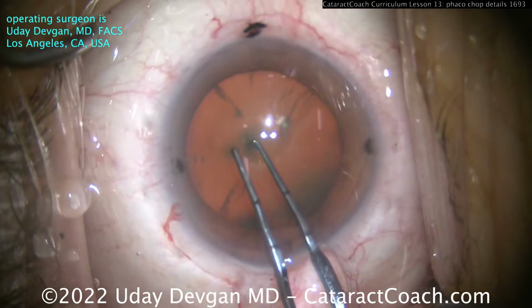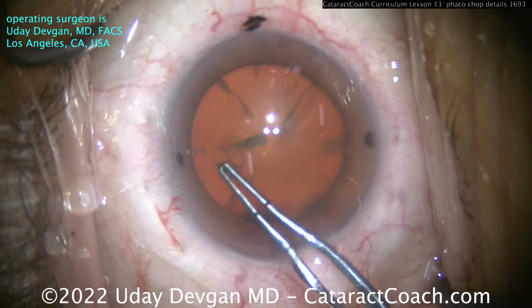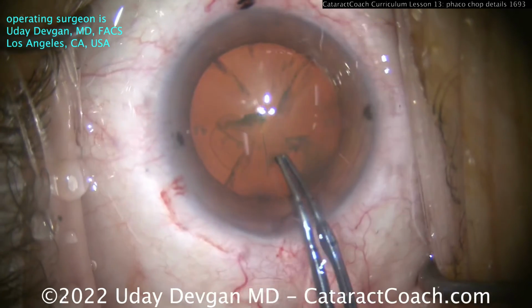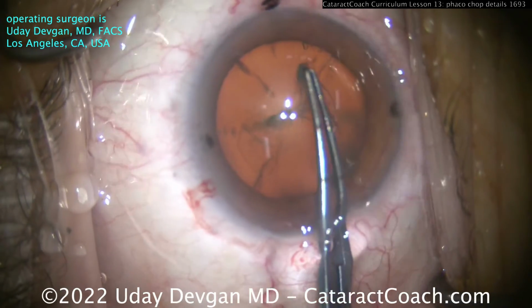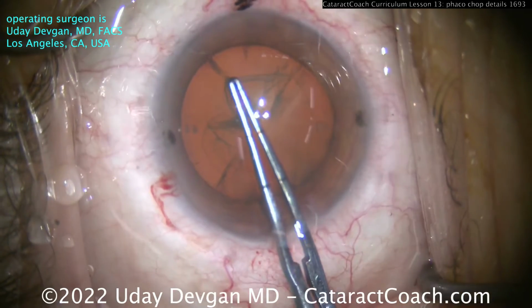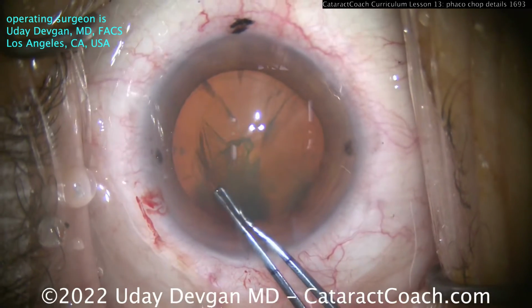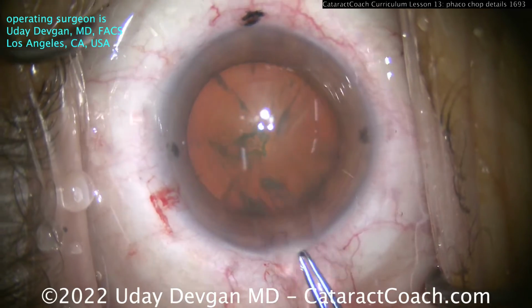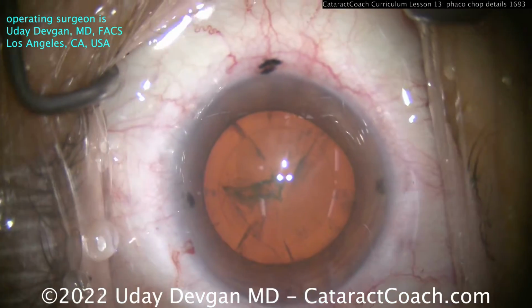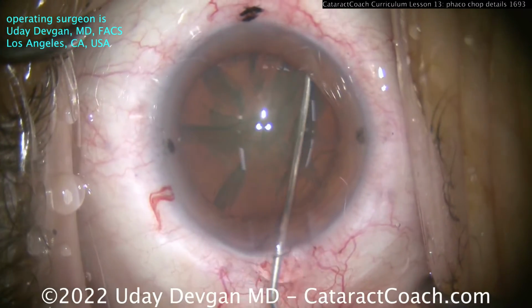And the second thing is the rhexis. In order to get a heminucleus out of the bag, we need to have a sufficiently large capsule rhexis. Now, if you make a small rhexis, let's say 4.5 millimeters in diameter, you can divide the nucleus or chop it into quadrants and take each quadrant out of that smaller capsule rhexis. But if you want to get a whole heminucleus up, you need to have about a 5 millimeter rhexis, like we just tore there. And that's going to allow us to bring a heminuclear fragment out of the bag, a whole half.